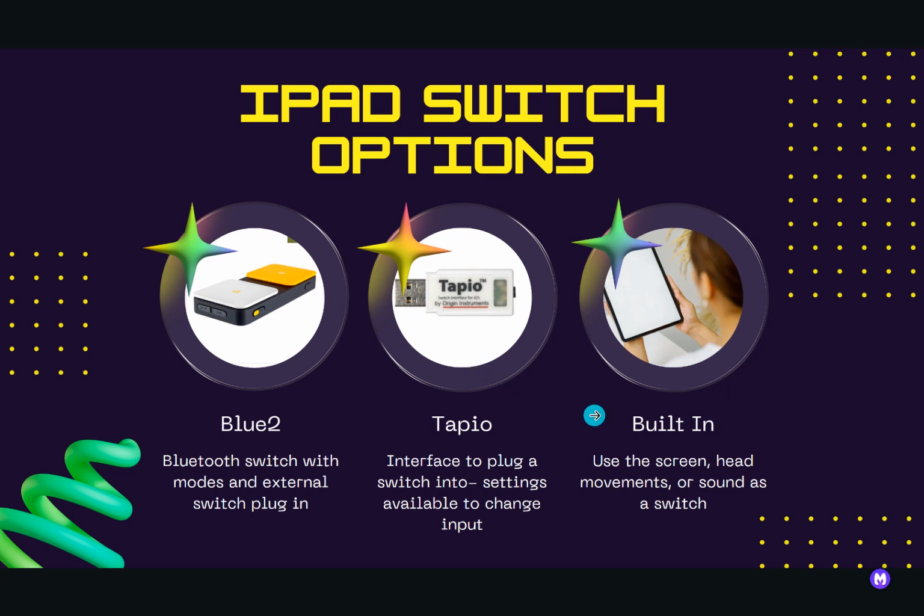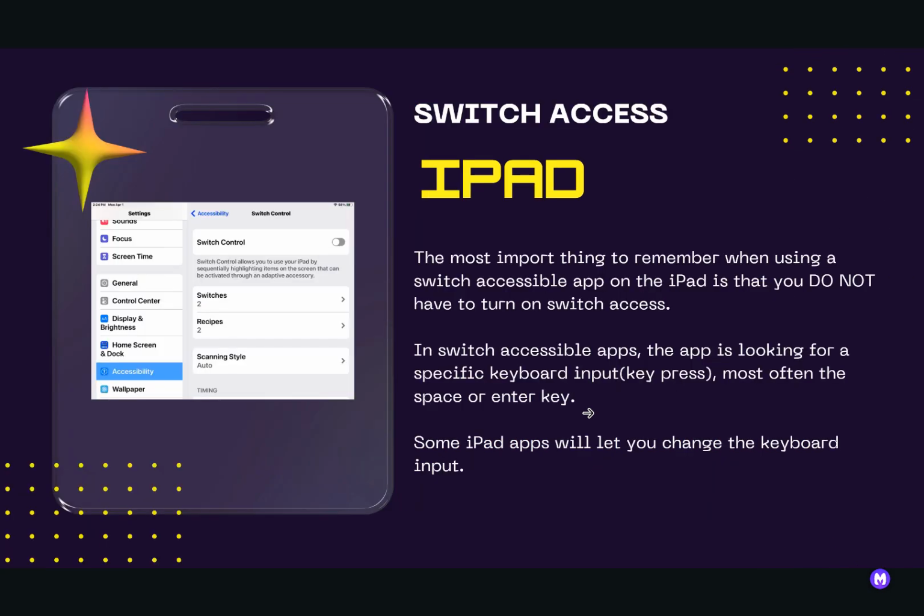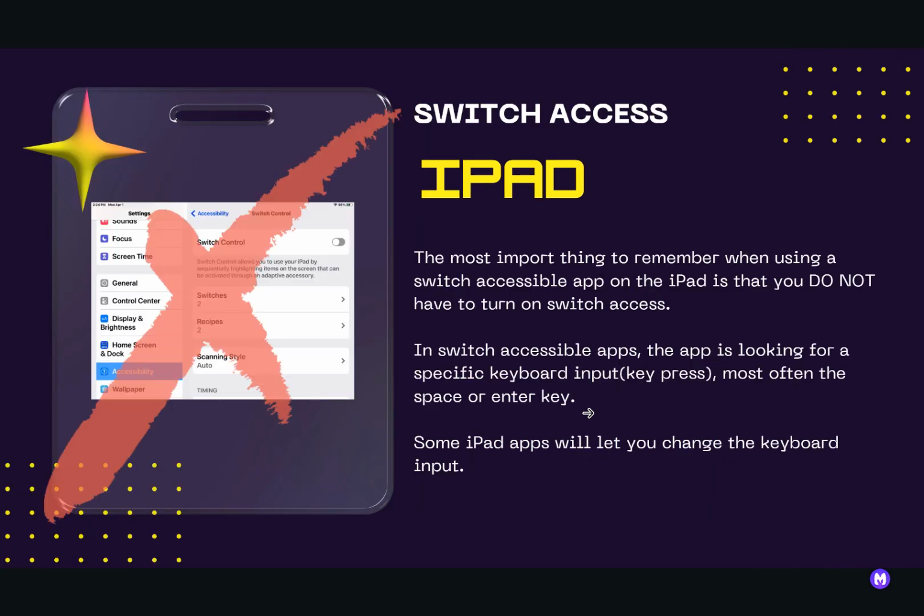And then there are some built-in options for switch use with the iPad. So a student doesn't even need an external switch. If they can tap anywhere on the iPad screen, or move their head, or make a consistent sound, they can use those things as a switch. So let's talk about iPad switch access.